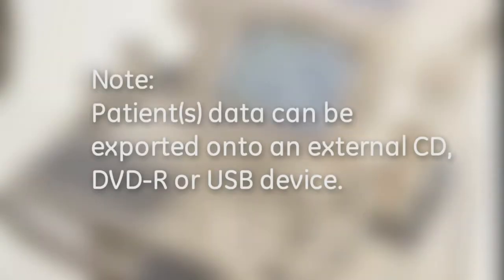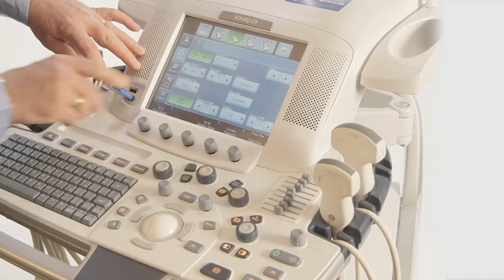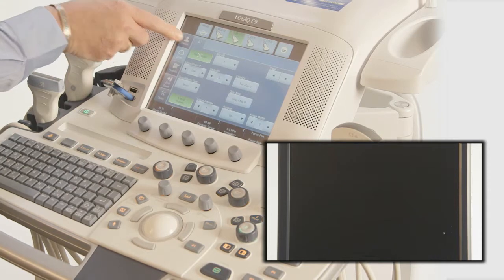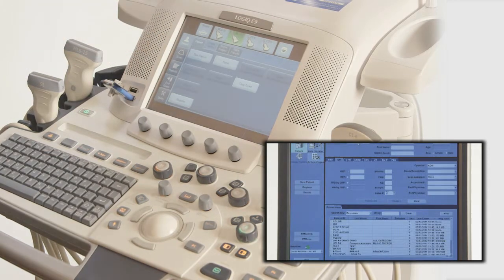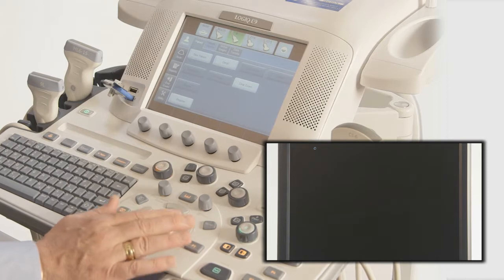To export a patient or patients onto external media using either a CD, DVD-R, or USB device, insert the media into your system. Select Patient on the touch screen, and then on the upper monitor, select Data Transfer.